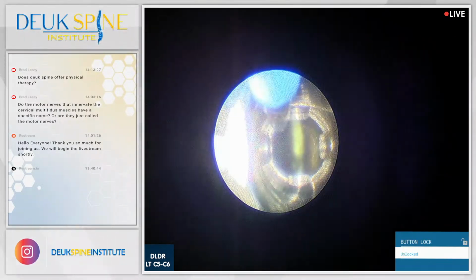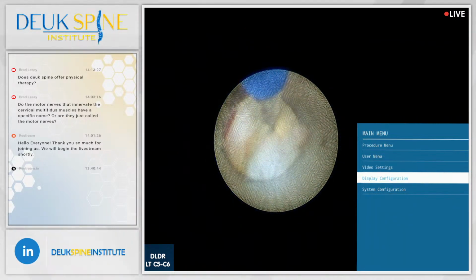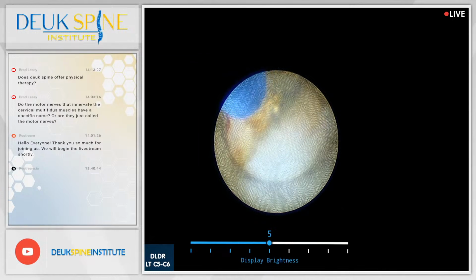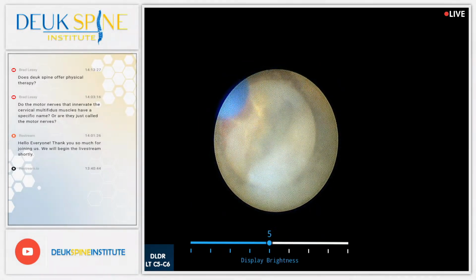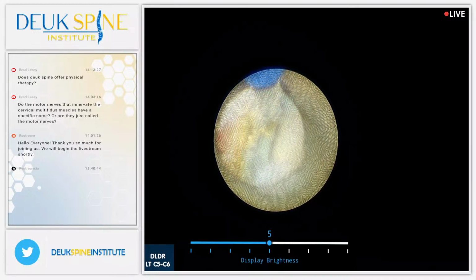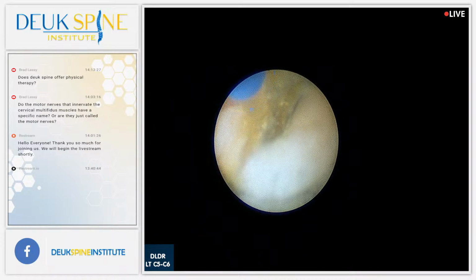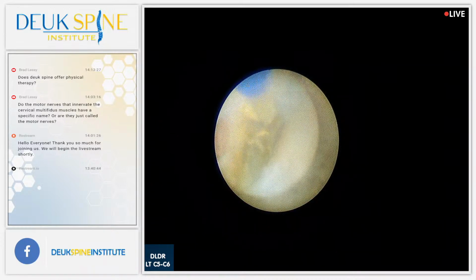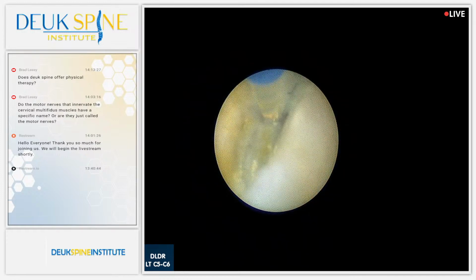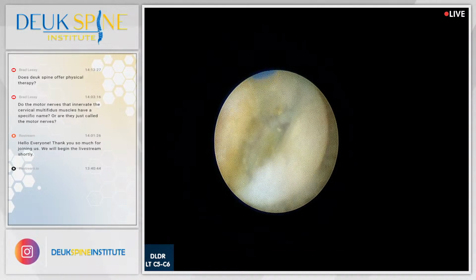Do you guys see that? Yes, we do. So it requires all that just to adjust? Yes, sir. Why is that? If I did it from the camera head, we could bring it down from there. So the surgeon has to stop operating in order to make the adjustment, pretty much. Essentially, yes. We can do a preset setting for this type of procedure where it drops the brightness down. But we don't know. That's the problem. Every patient's different.